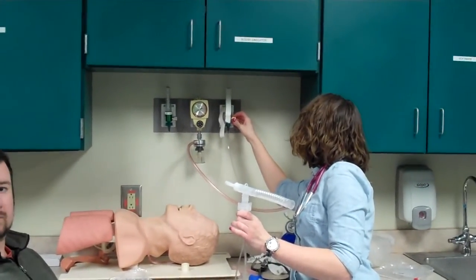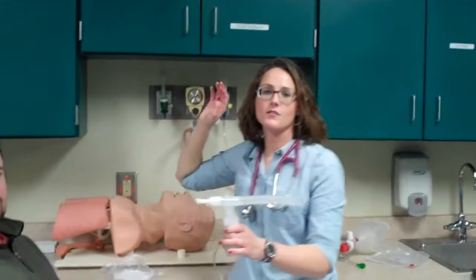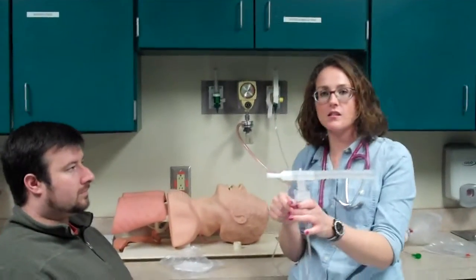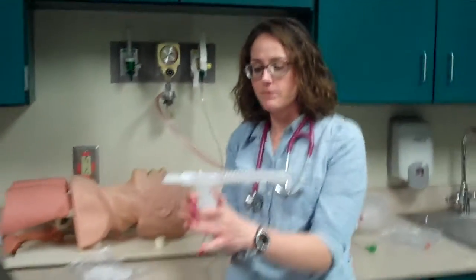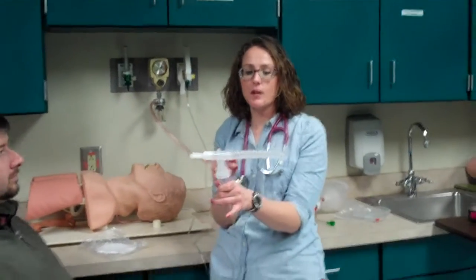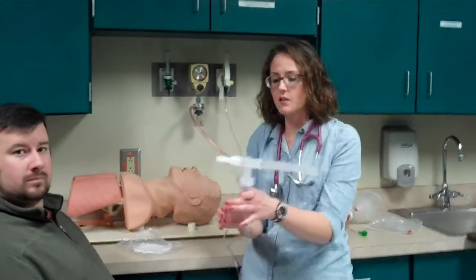So Victoria, does it matter if you use oxygen or air? No, you should use oxygen. We just don't. But does it matter? Oh no, not really. Not unless the patient really needs it. And what flow rate did you set it? I can't see it because of the tape. 7, but it should be between 6 and 8. Okay, and that's set by who? The therapist, it depends. Oh, the 6 to 8? Yeah. That's set by the manufacturer, the company that made this. Very good.